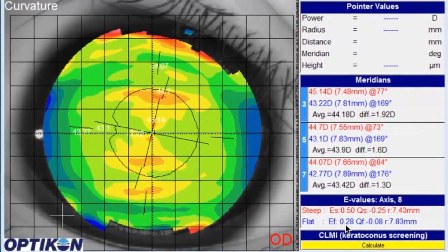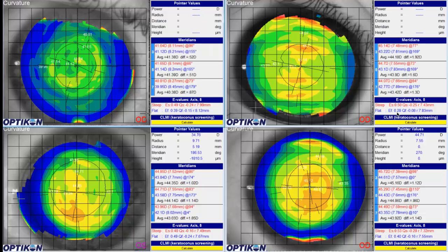And then finally I'll take a look at corneal toricity. Mainly I'm just looking to see right now how much agreement there is between corneal toricity and cylinder power in the patient's refraction. So this initial survey gives me a pretty good idea how smoothly I can expect treatment to go, and allows me to better set expectations both for myself and for the patient before we even start OrthoK.